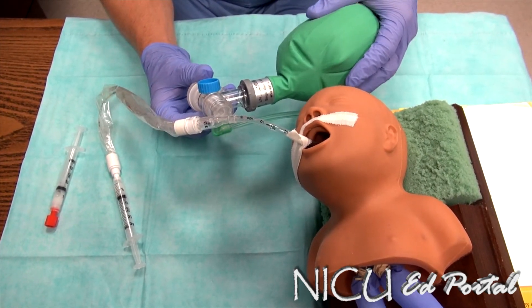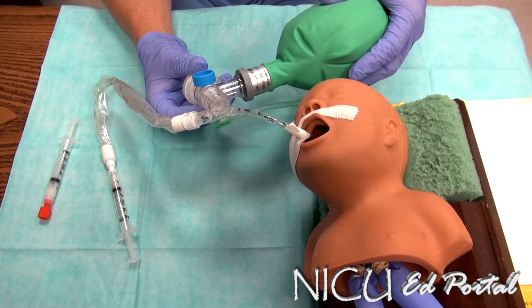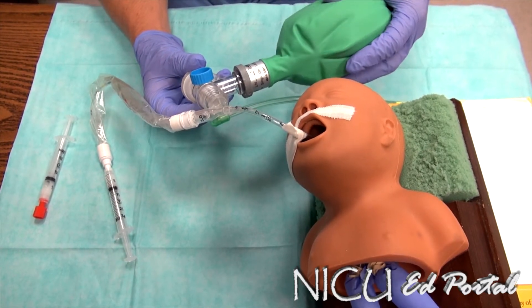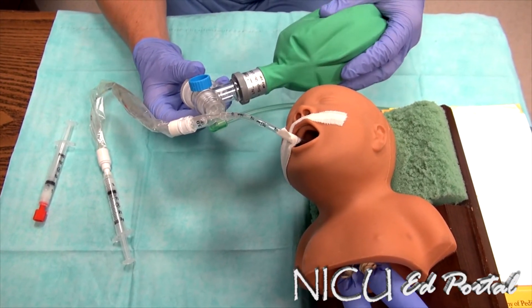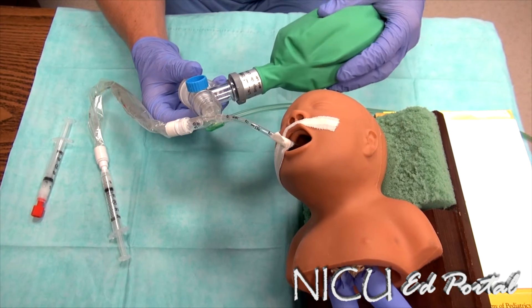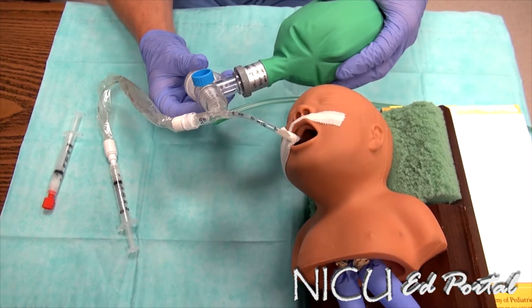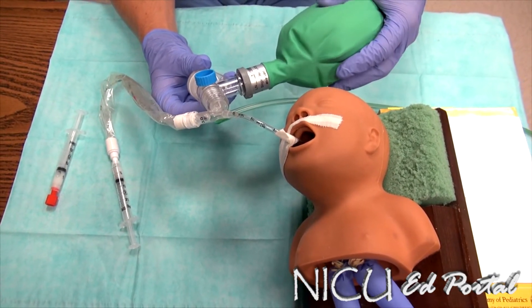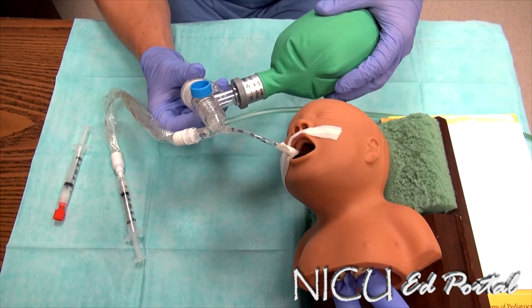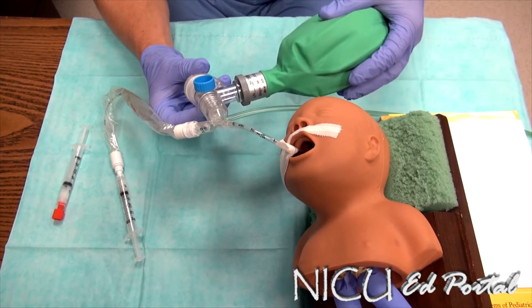Prior to administration of the first aliquot, things to consider: making sure the baby is stable — vital signs, saturation, heart rate. Also, after intubation, listen for bilateral breath sounds, making sure the tube is in proper placement. Prior to administration, bag at a normal rate. After administering the surfactant, we may bag at a slightly faster pace. The baby is stable and we are tilted to the right side, ready to administer the first of the two aliquots.